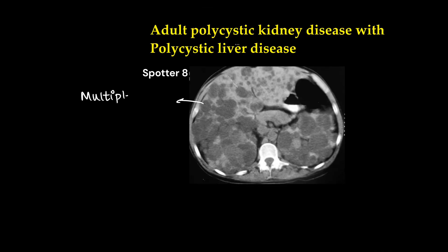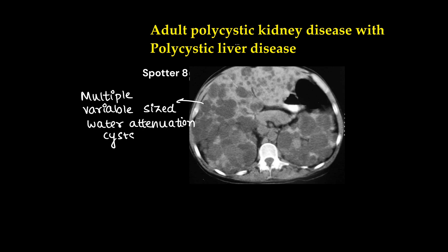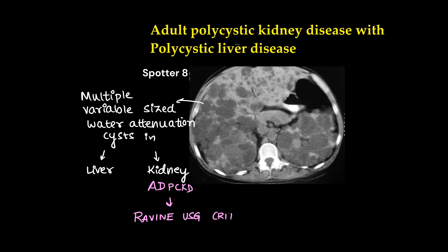This is adult polycystic kidney disease with polycystic liver disease. Multiple variable-sized water-attenuation cystic lesions are seen in the liver, which usually do not have any septations or solid component. We can also see involvement of the kidney. The diagnostic criteria for adult polycystic kidney disease is the Ravine criteria — you can read up on that.